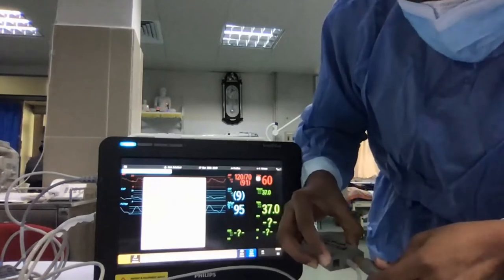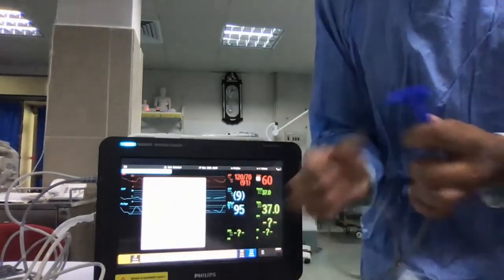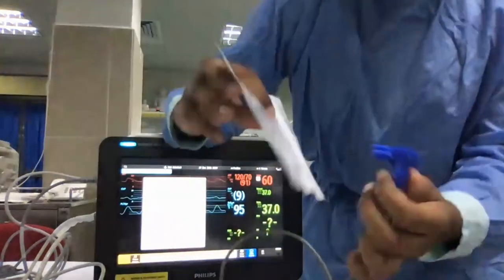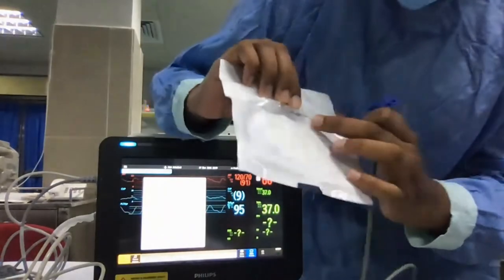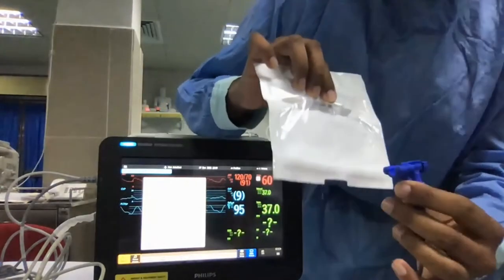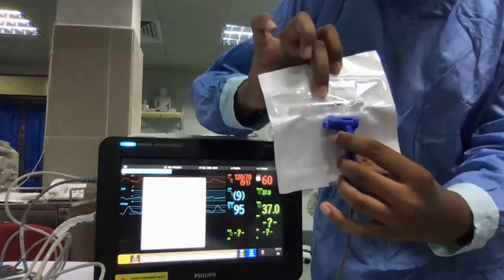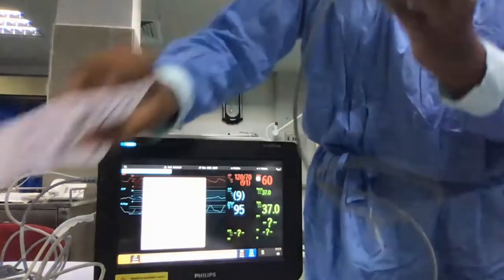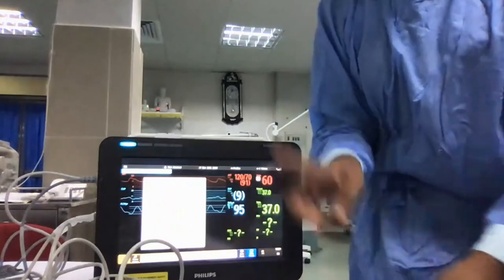So you can connect it like this. And then this blue color temperature port, you can flush this and connect it to the CVP line, and you can connect this small tip, this is actually a sensor. So you can connect it like this. And this goes to the distal most CVP line. And then that procedure is okay. I think you have got a clear understanding from the video.